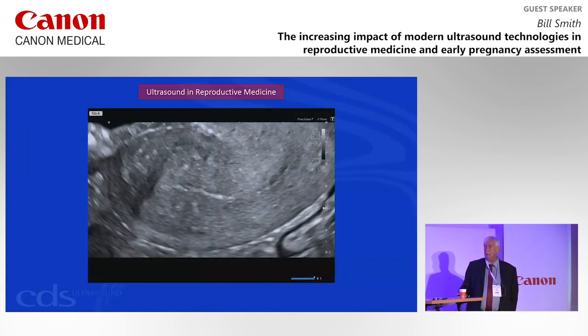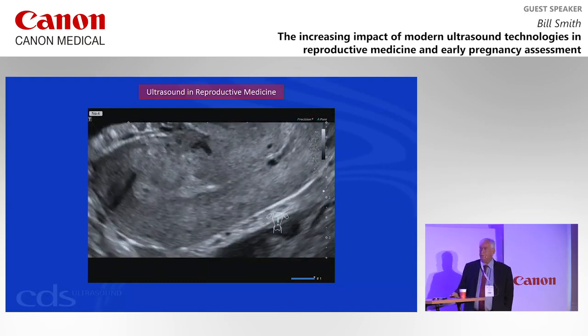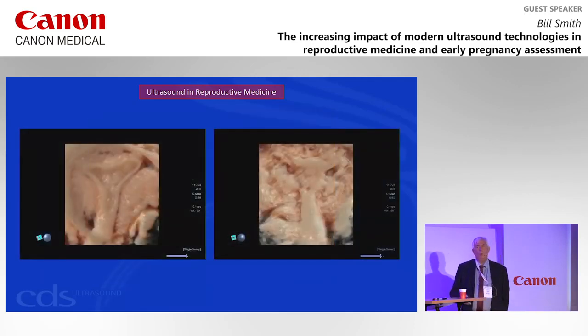And if we take this case here, this is our post-menses scan. You can see the myometrial glandular changes I was alluding to. And you can see how, when you get to the periovulatory stage, the adenomyosis can affect the endometrial appearances there. So this is another example of why we need good grayscale as part of our approach to reproductive medicine. Obviously, 3D is very, very useful.